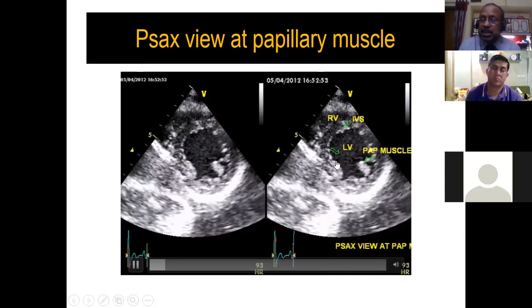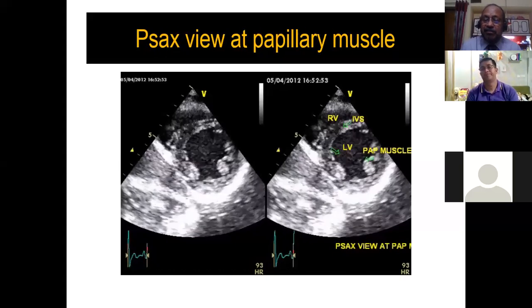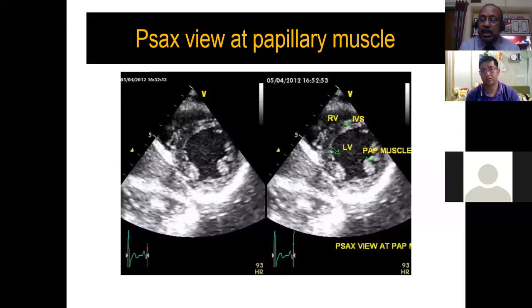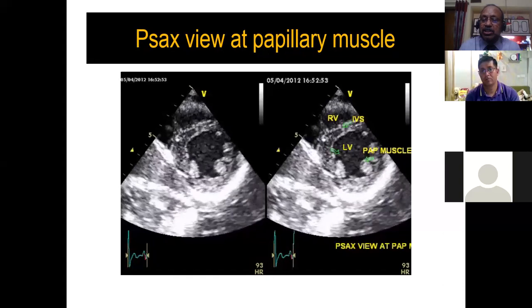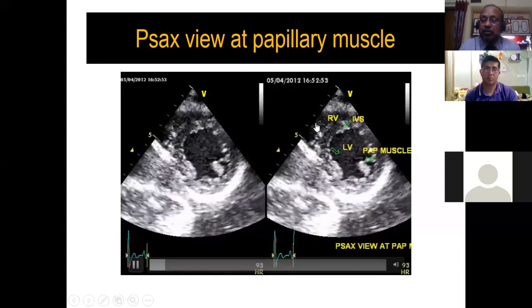So looking at the septum itself, you can jolly well say whether this patient has got an elevated PA pressure or not. That is qualitative evaluation. I'm not saying quantitative evaluation. So every image tells you, every echo image speaks. Look, there's something lying in this image. So that's what this image tells you. Look at this septum. It's rounded. It's sickle shaped. RV pressure is much less than LV pressure.